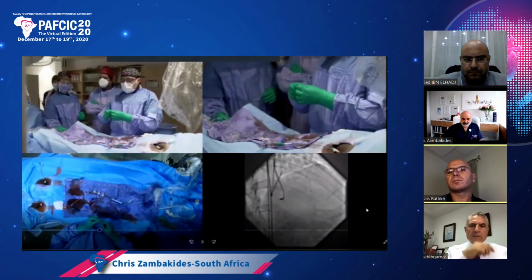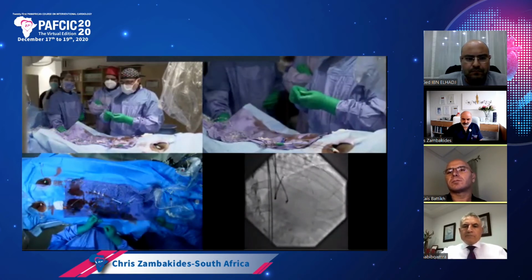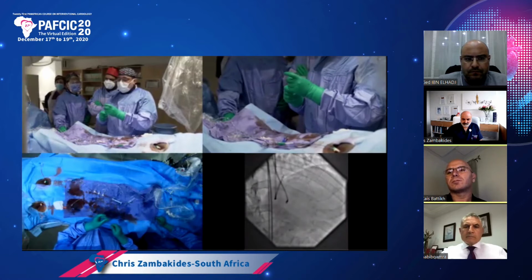Give me the shaping needle. Yeah, so it has got that funny upward bend. Let's hope we can take it.